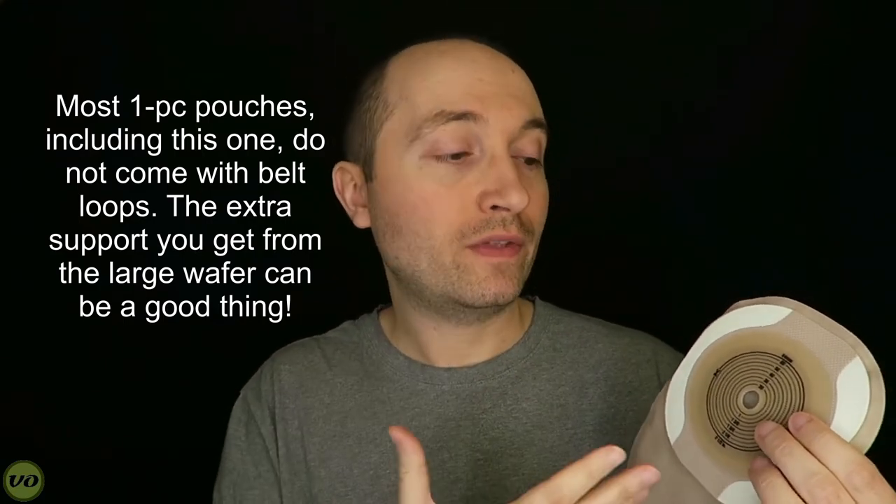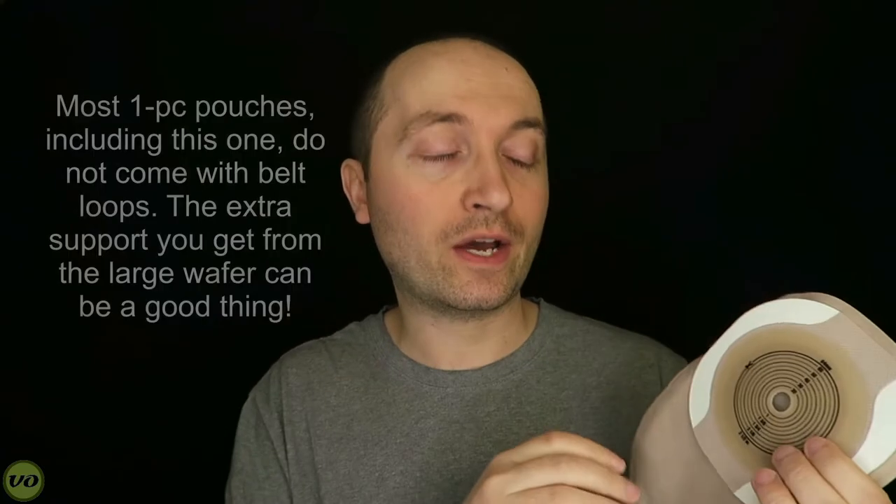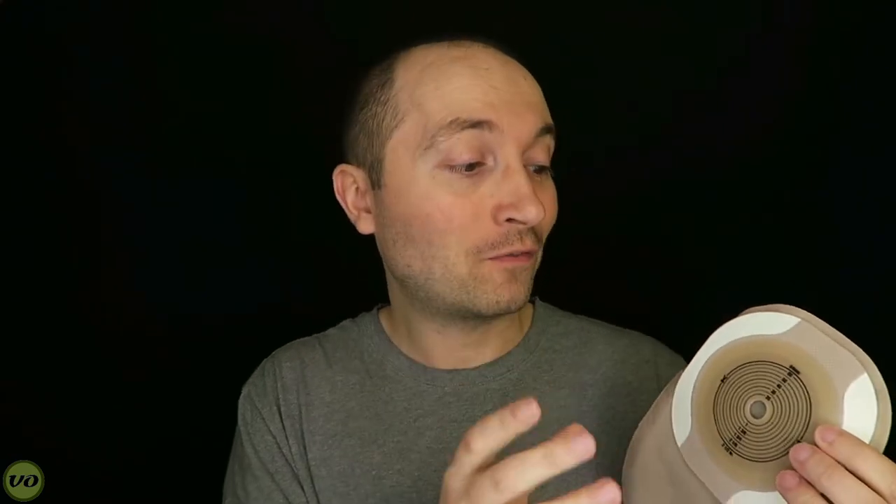In my experience wearing this appliance for many weeks, when you first put it on you feel the size, but as the day goes on you really don't notice it anymore. However, the size may be an issue if you're using a support garment like a Stealth Belt sized for a two-piece — even cutting the wafer smaller, there's still a very large area where the flange usually would be. Some accessories may not fit as well, and you may have to go with a much larger size to accommodate it.